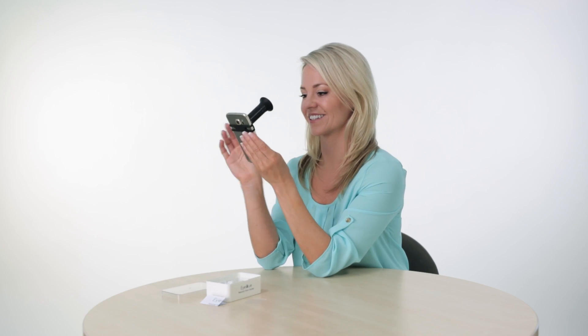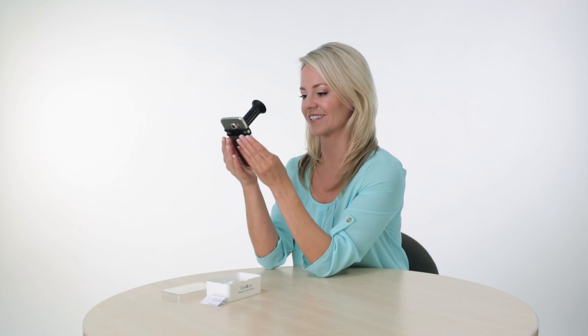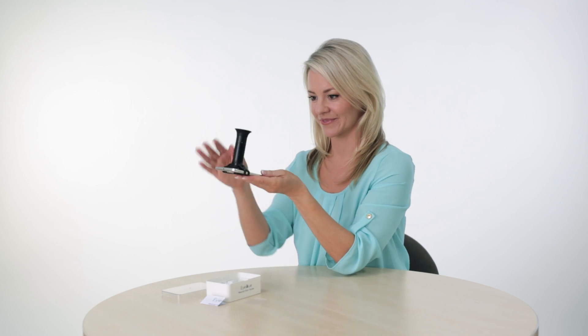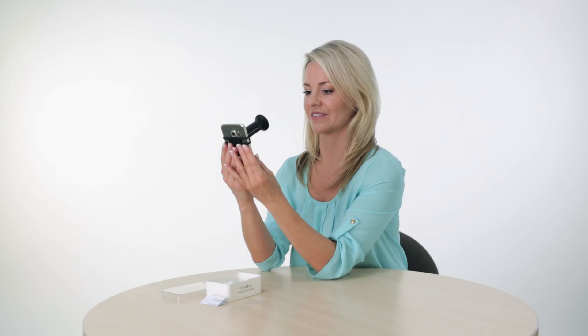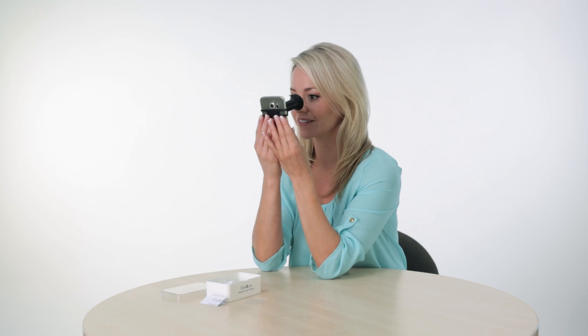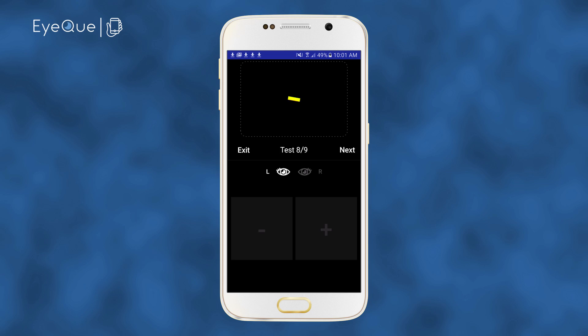After completing all nine right eye measurements, you will be prompted to switch to your left eye and to reset the mini-scope back to position 1. Continue taking the left eye measurements in the same way as you did for your right eye until all nine measurements have been taken.